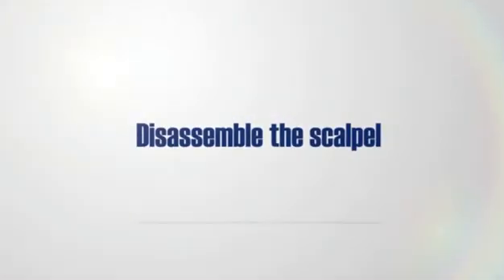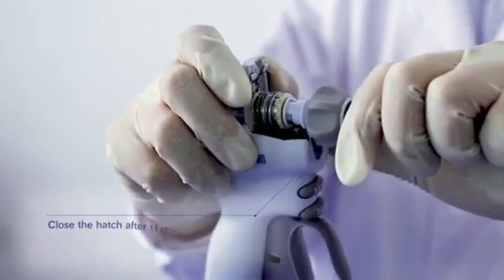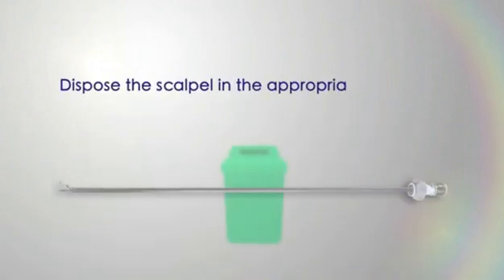Disassemble the scalpel. Unlatch and open the hatch. Separate the scalpel from the handle. The handle is reused. Please keep the handle locked before sterilization. Dispose of the scalpel in the appropriate container.